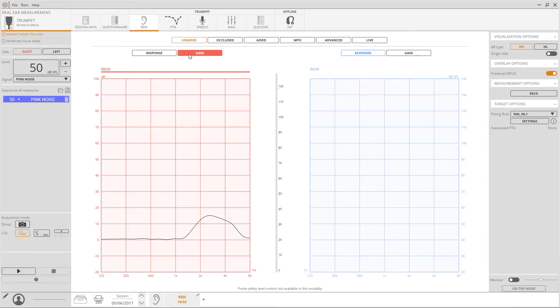Please note that the acquired measurement should be represented either as the signal caught by the probe microphone, called response, or as a differential value between the probe and reference captured signal, called gain. During this video series, all examples will be displayed as gain.